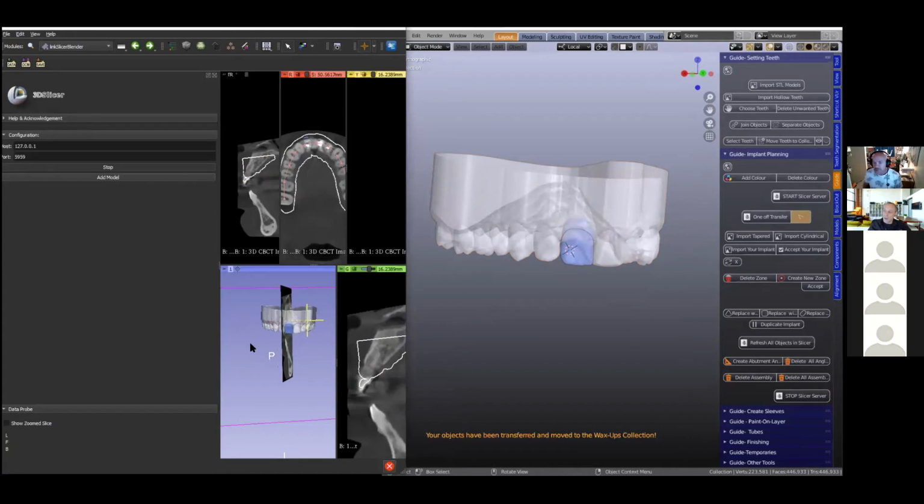We had one question about the contrast, if you can set contrast in 3D Slicer, but maybe this is a little bit off subject. You might want to elaborate on that later. Is it the contrast of a model or the contrast of a volume? Just managing contrast, yeah. Okay, yeah, don't worry, we'll go back to it later.